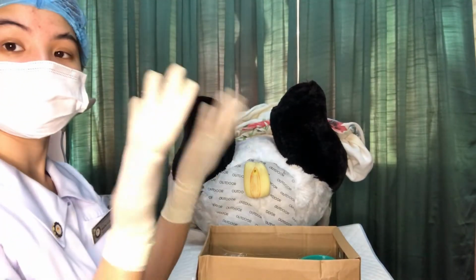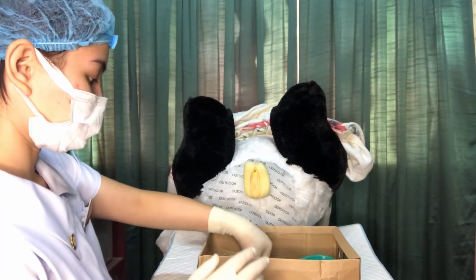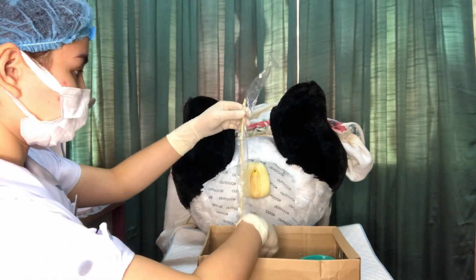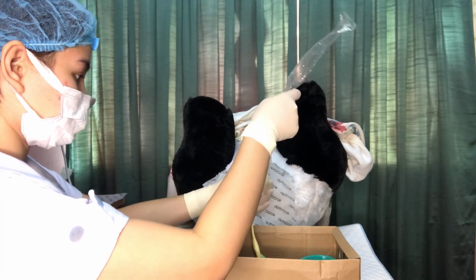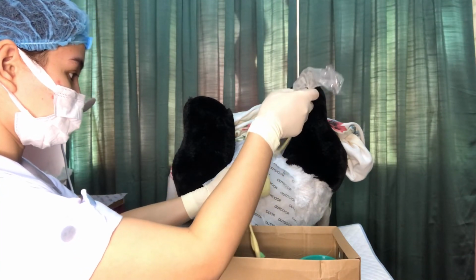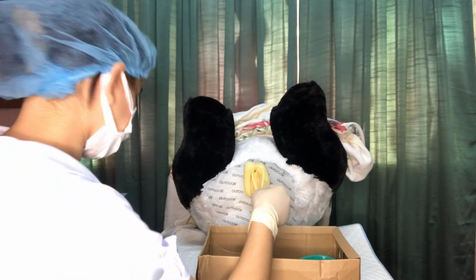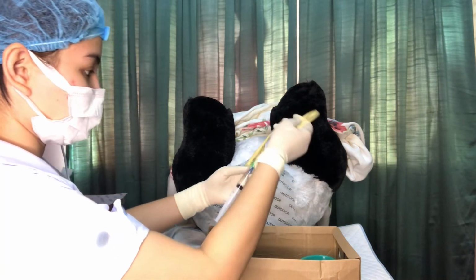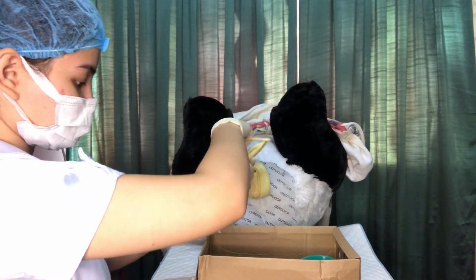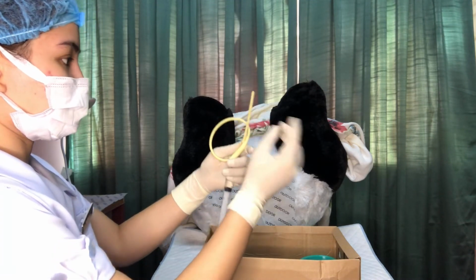So as you can see, I already put on my new sterile gloves. I wore a mask and a hairnet because this one is an aseptic method. And then this is my size 12 Foley catheter since this one is the only size available. There is a syringe attached to it. So first we're going to check if the Foley catheter will inflate.